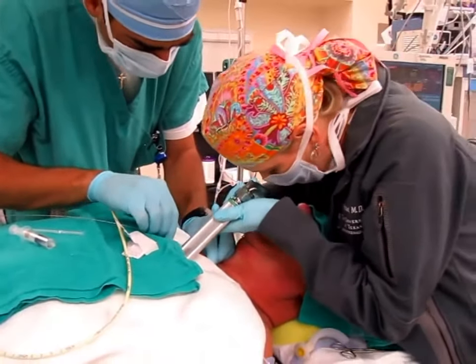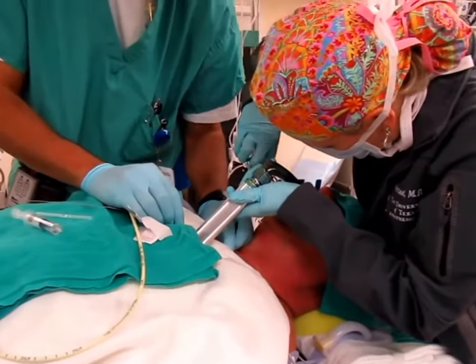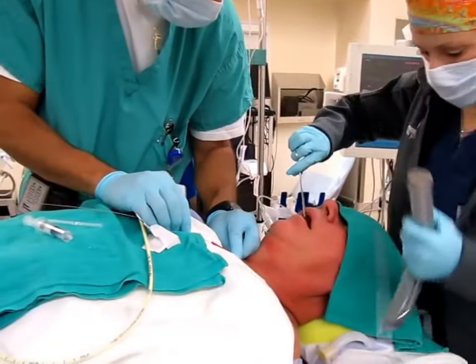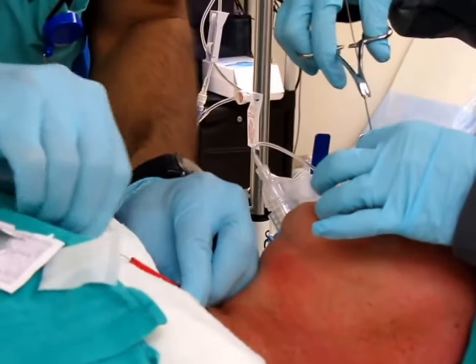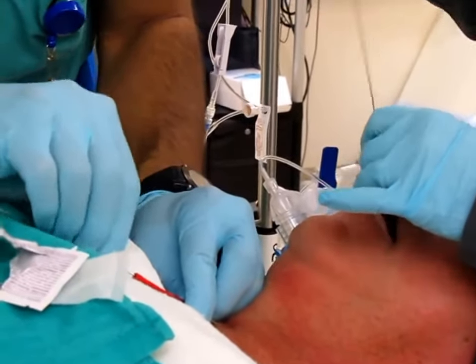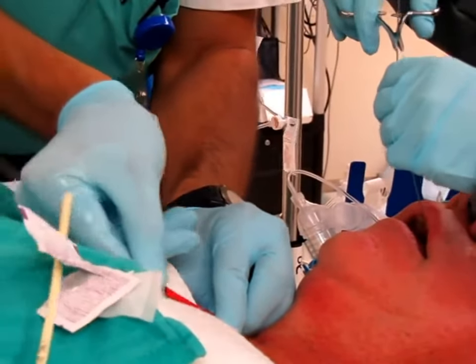Here we can see. We've had enough — now you push. Push it all the way through, and you're going to see that black second black line go all the way through. Push, push, push.